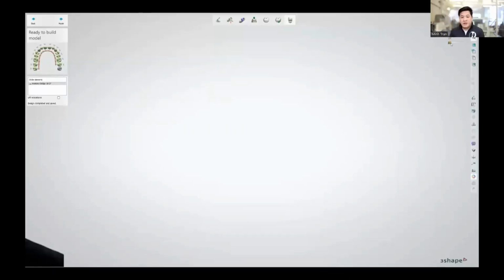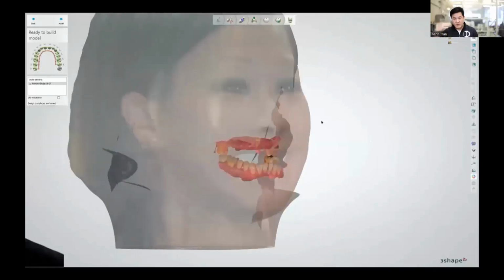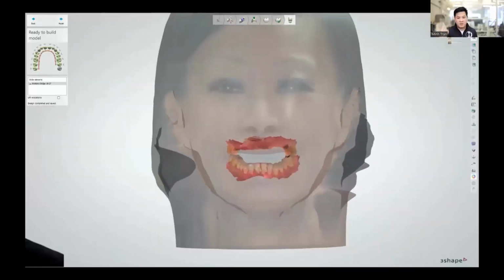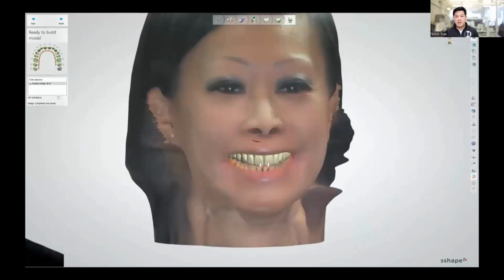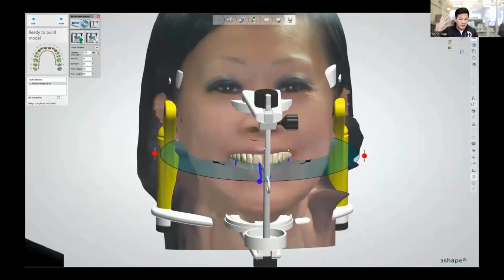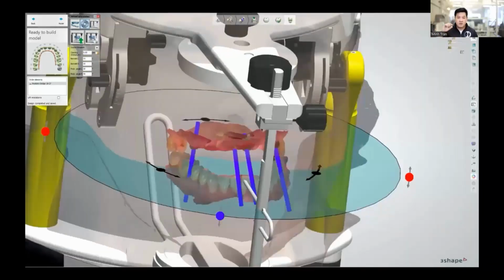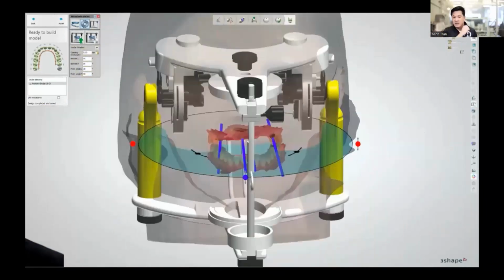So another example here actually of this time incorporating a 3D face scan instead of pictures, and just demonstrates how we use temporary on prepared model, again, for a preliminary design, right? So this time we set up the diagnostic as a temp on prep. This is fully partially edentulous, but we treat it basically as fully edentulous for implant retained purposes. And I just go ahead and use this order and I just add one additional pontic, usually like a 7 or 8. And you put it back there and you use that as a special object for your tissue. So you design all this stuff, design your gingiva.